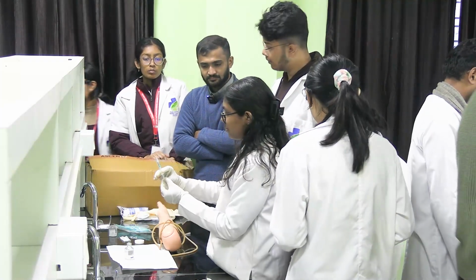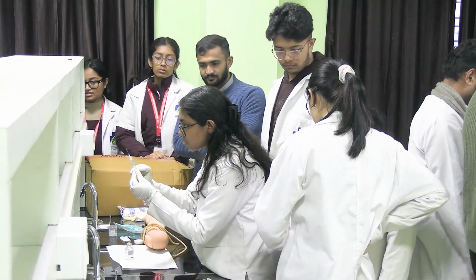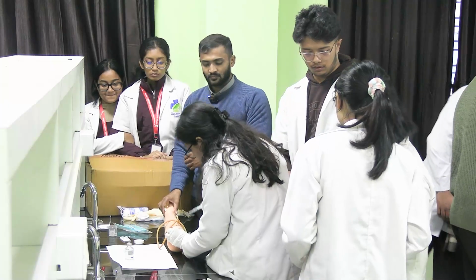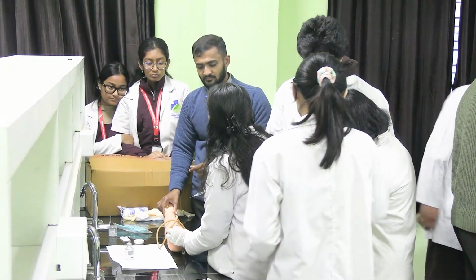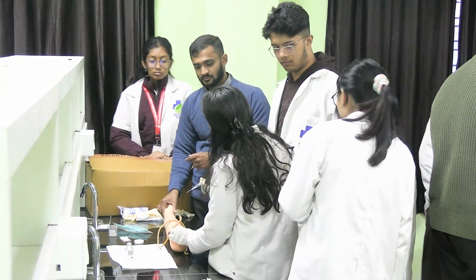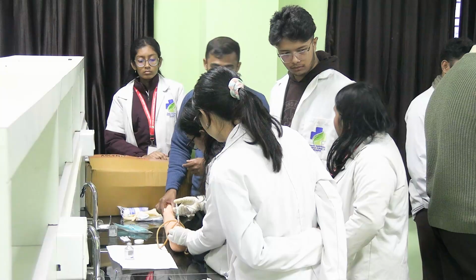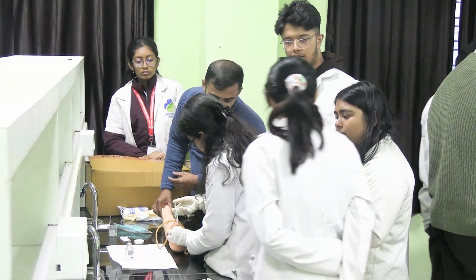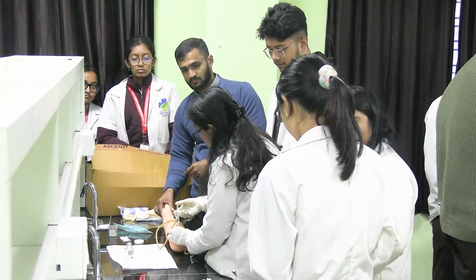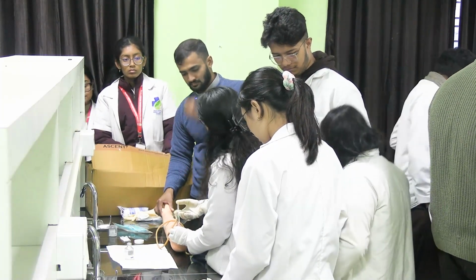After taking, what is the next step? I'll lift up the area. What should be the needle size? Size 1 inch. Then I'll insert the needle at a 45-degree angle. Go in. Now I'll check whether there is any blood vessel or not. I'll lift the plunger, and if no blood comes out, then it is fine.